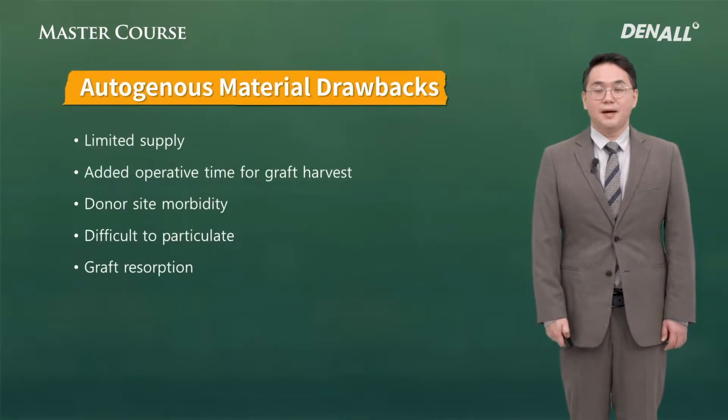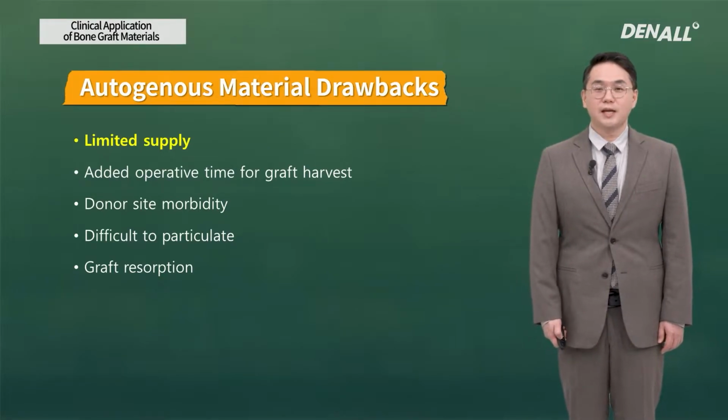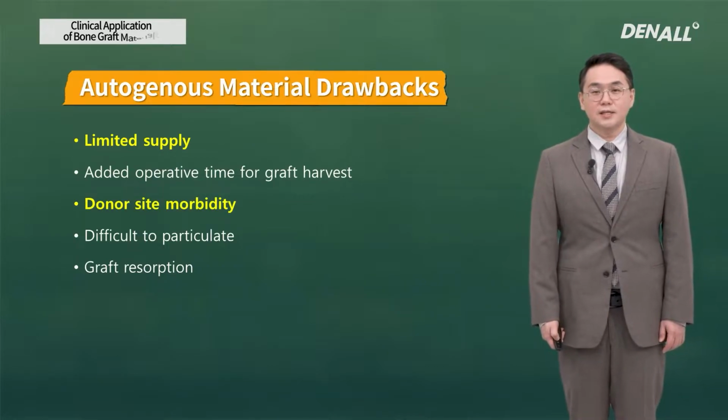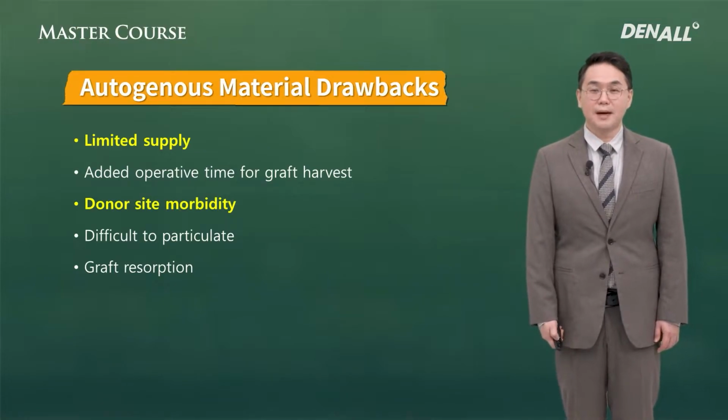But the amount that can be harvested is limited, and you need an additional surgical site. So the donor site morbidity would give discomfort to the patient. So clinically, this is not a preferred method, and we use a lot of commercial bone materials.